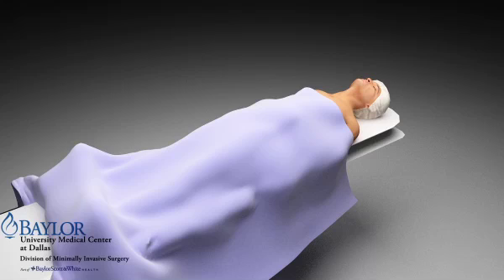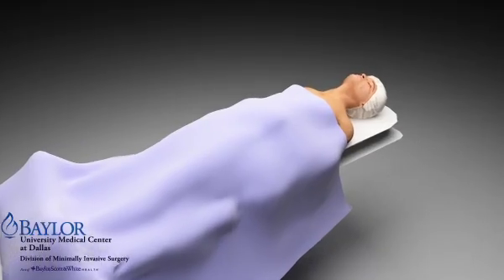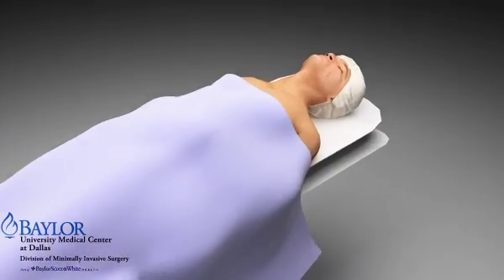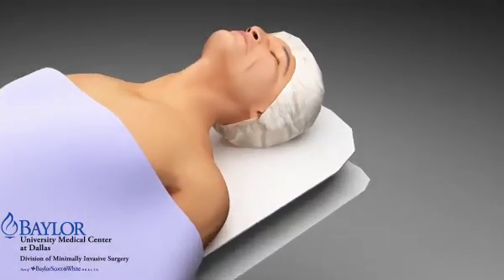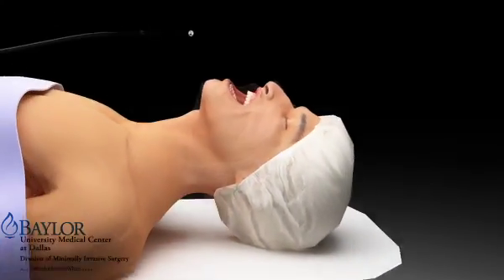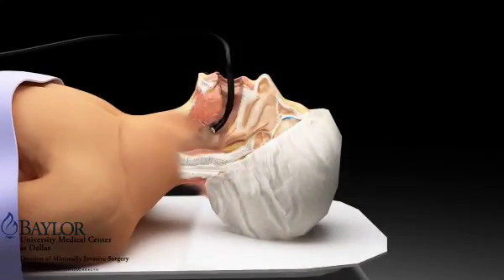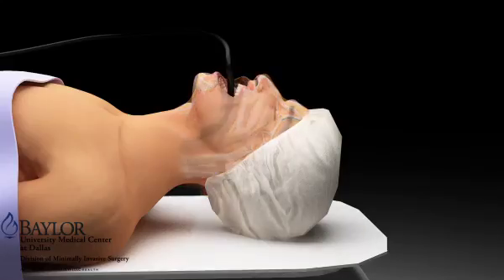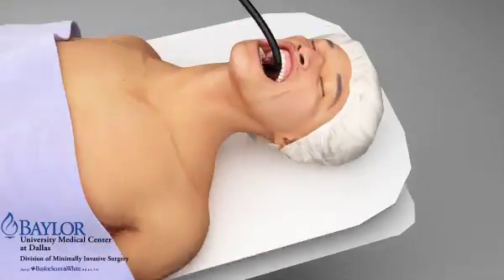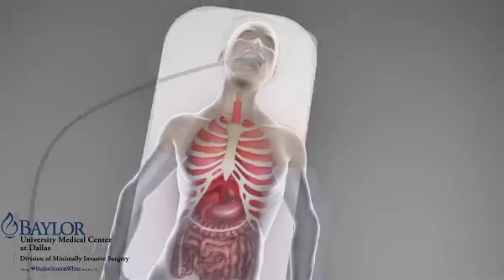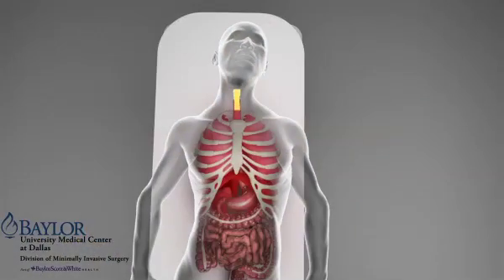The procedure begins with the patient in the supine position. A bite block should be used, and the patient should be under general endotracheal anesthesia. This helps to protect the airway during the passing and retrieval of the endosponge.